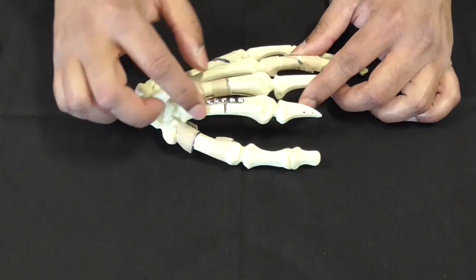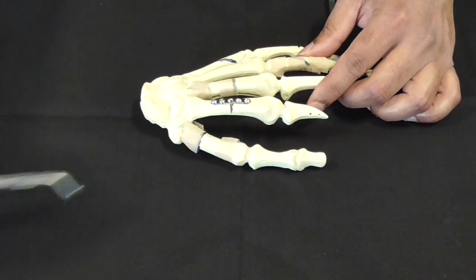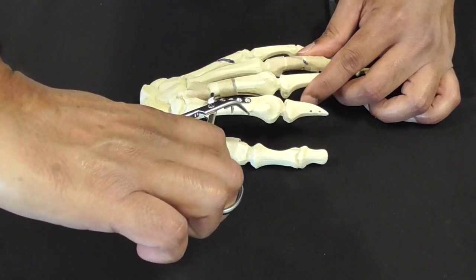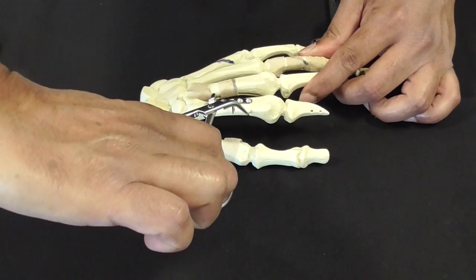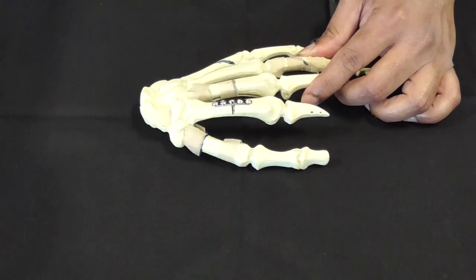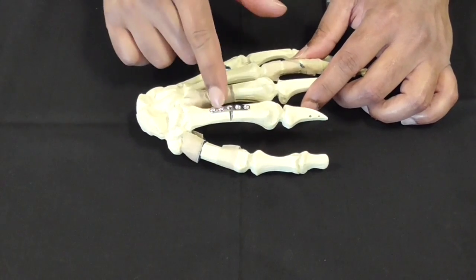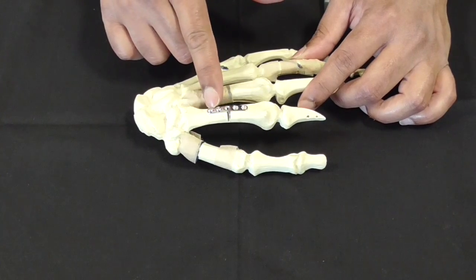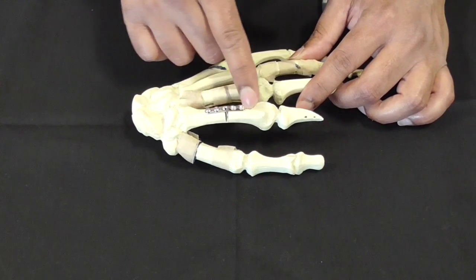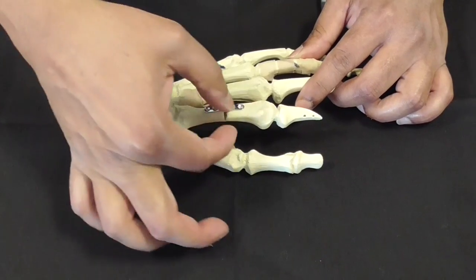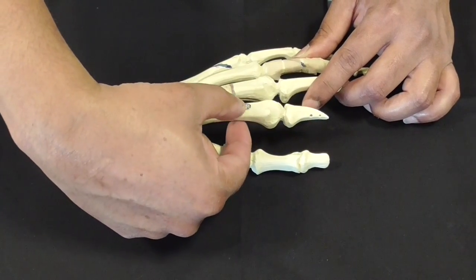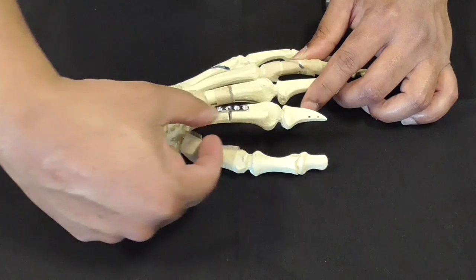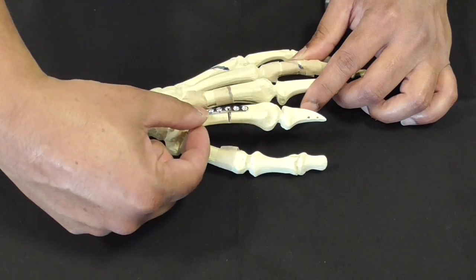If you've got a fracture like this which is transverse, unfortunately you can't use one of these because it just wouldn't work. One way of dealing with that is to put the plate on one side first and then use this as a cantilever, and then you stabilize the plate onto the bone.